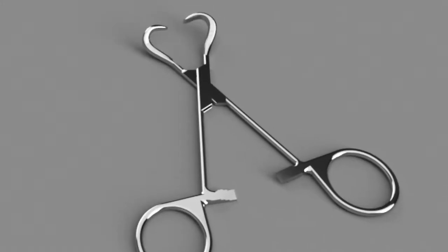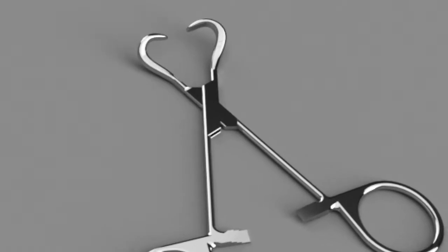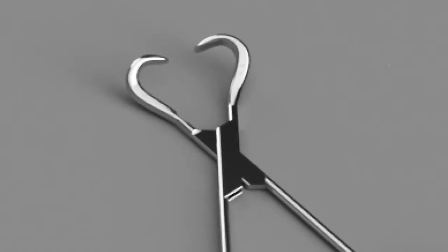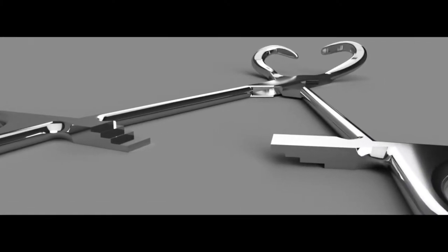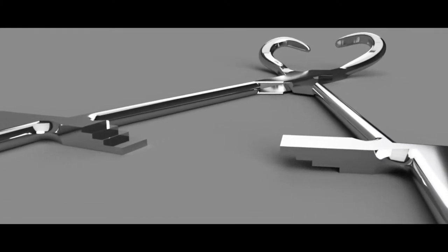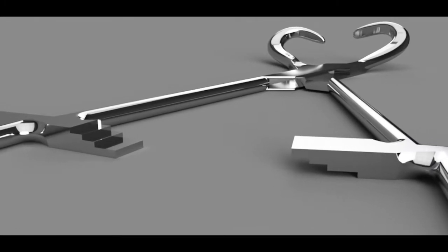Because the towel forceps are often clamped directly to the patient's skin, this clamp is designed to prevent damage to the patient's skin or any other complications. The second is the ratchet fixation mechanism near the handles, which allows the clamp to remain closed and be locked in place until manually released by the surgeon.